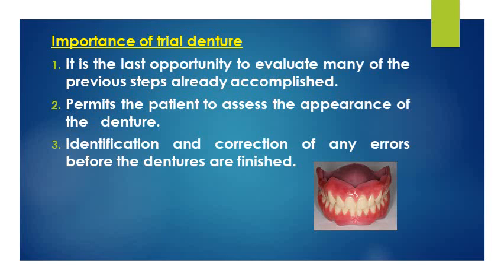Importance of the trial denture: it is the last opportunity to evaluate many of the previous steps already accomplished. So it is the final reversible step in complete denture manufacturing.